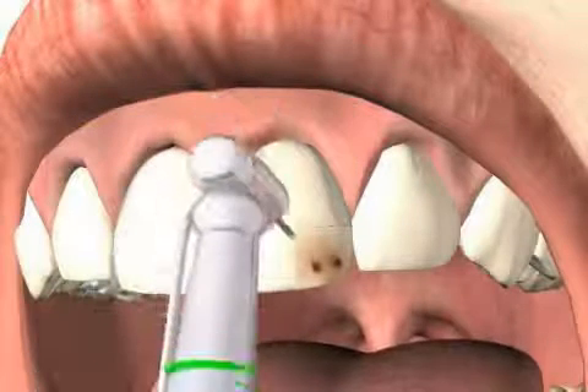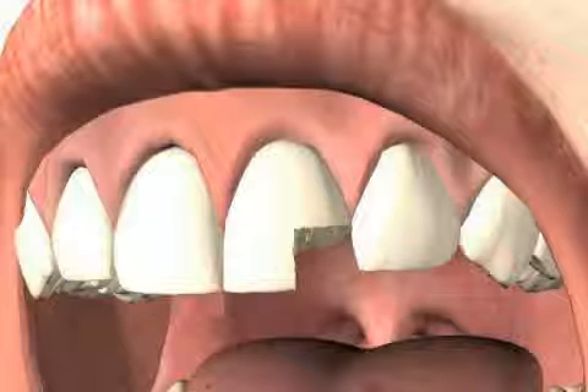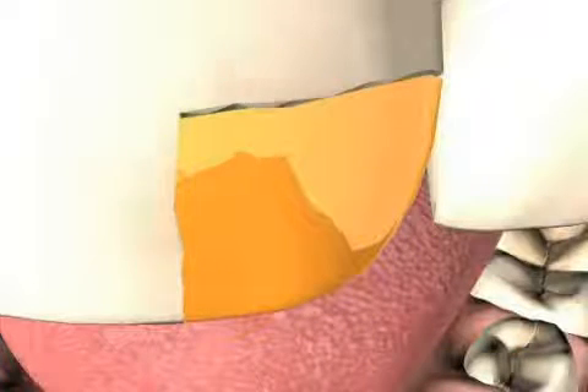In this animation, you can see a tooth being grinded with a diamond. One can clearly see the grooves on the enamel. If you were to cement something on this, for example a gold inlay, it will not isolate as well on the edges.